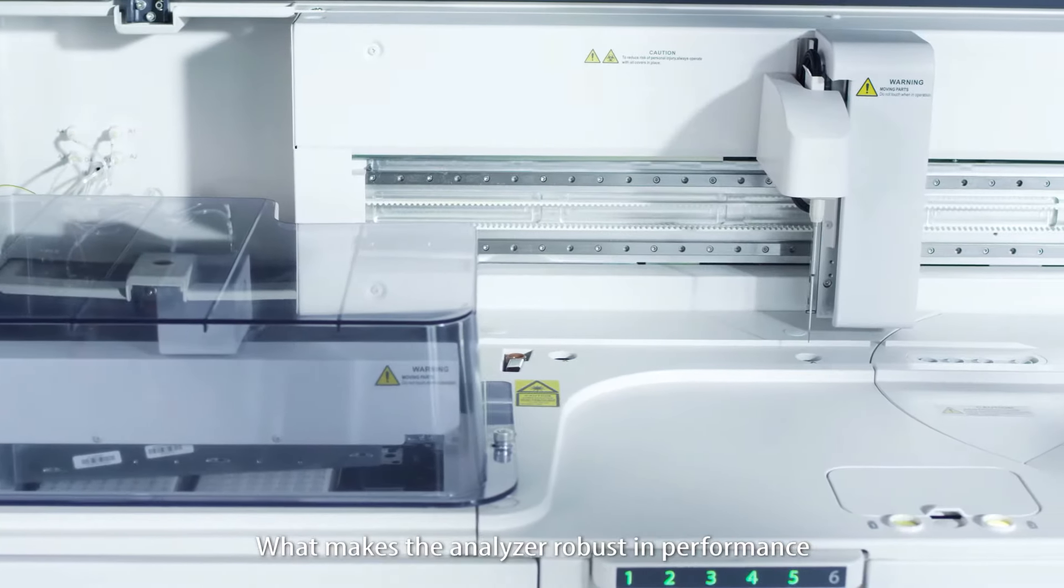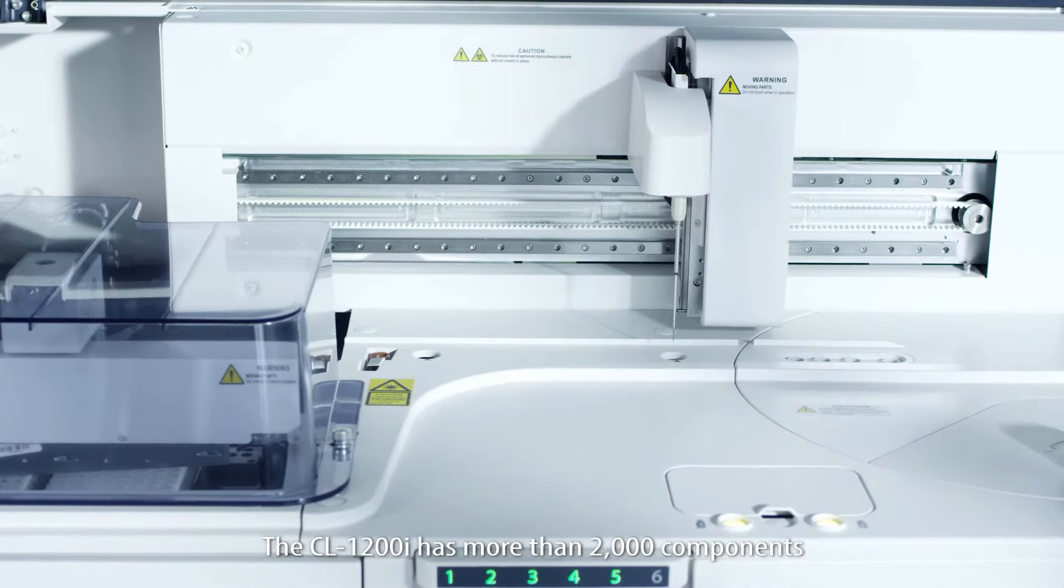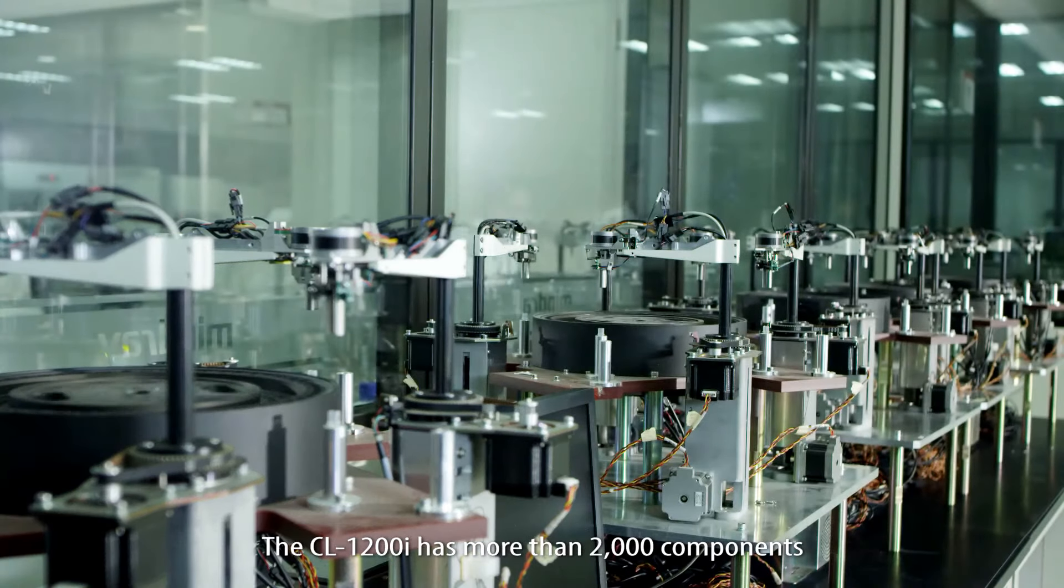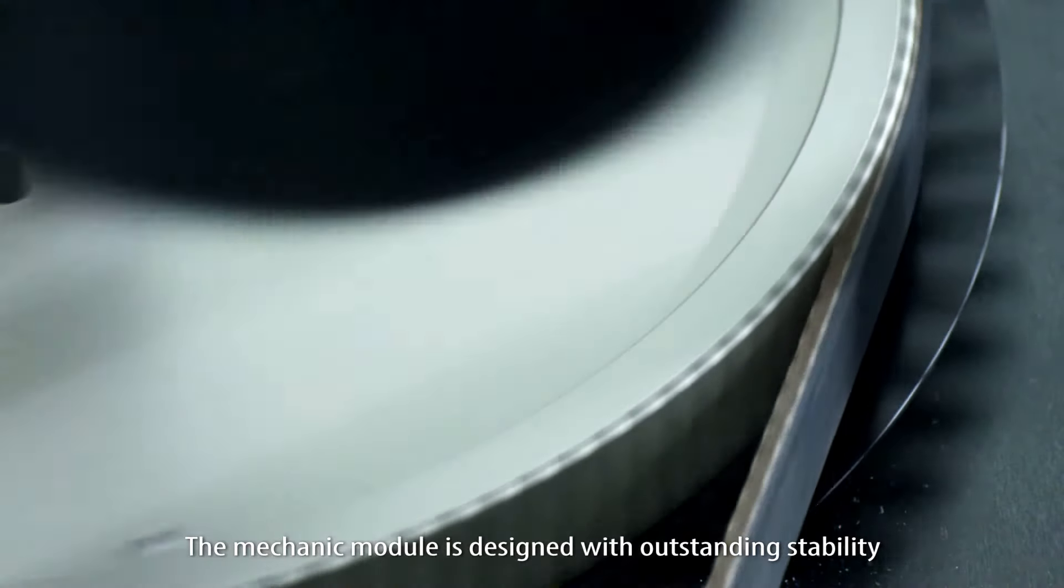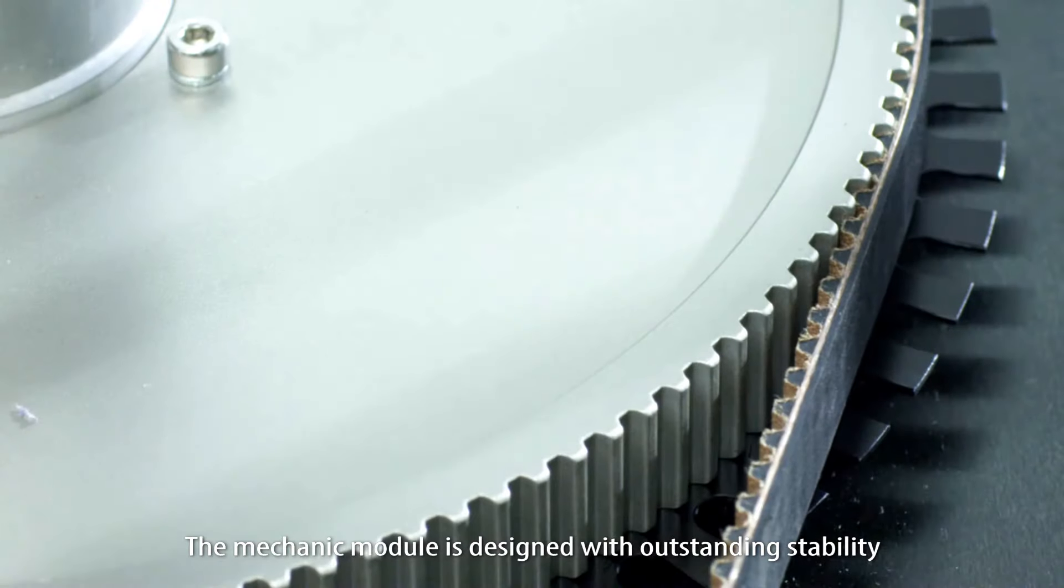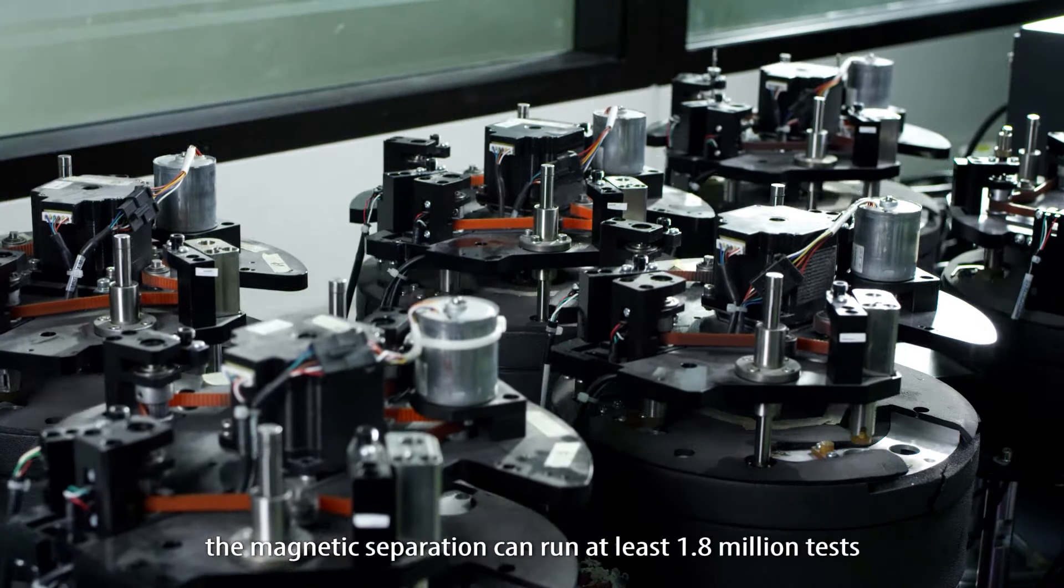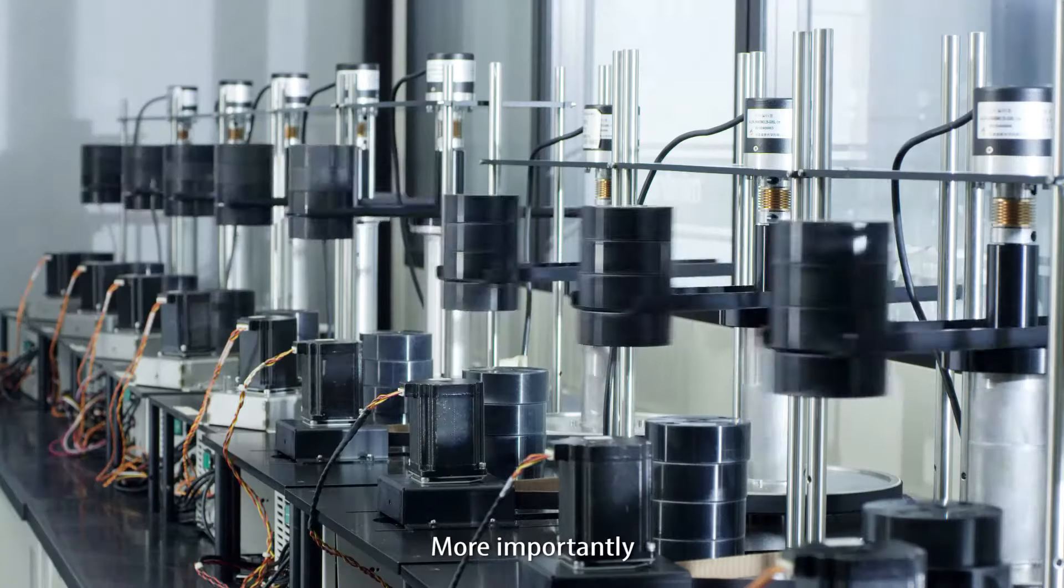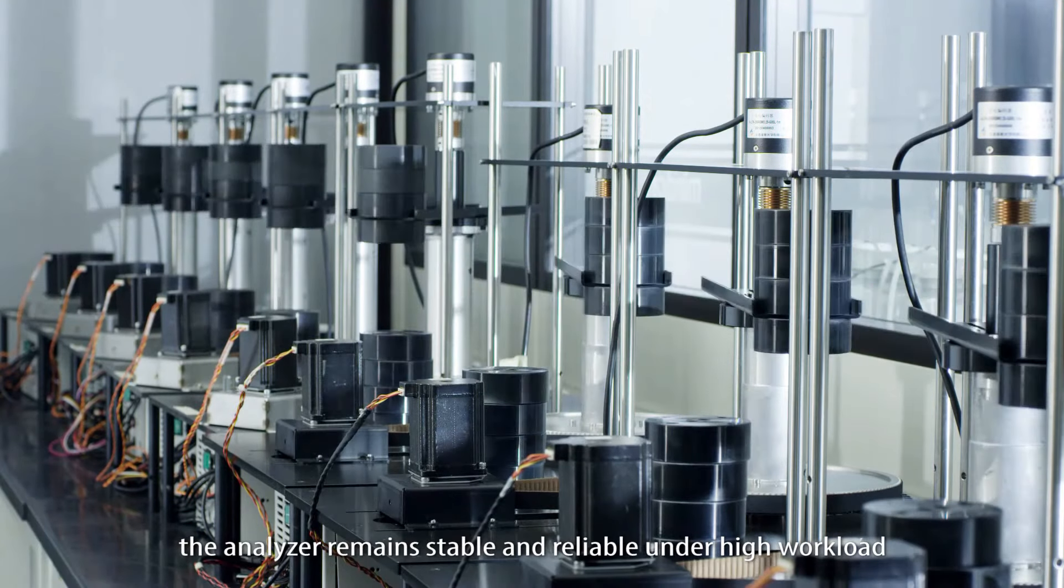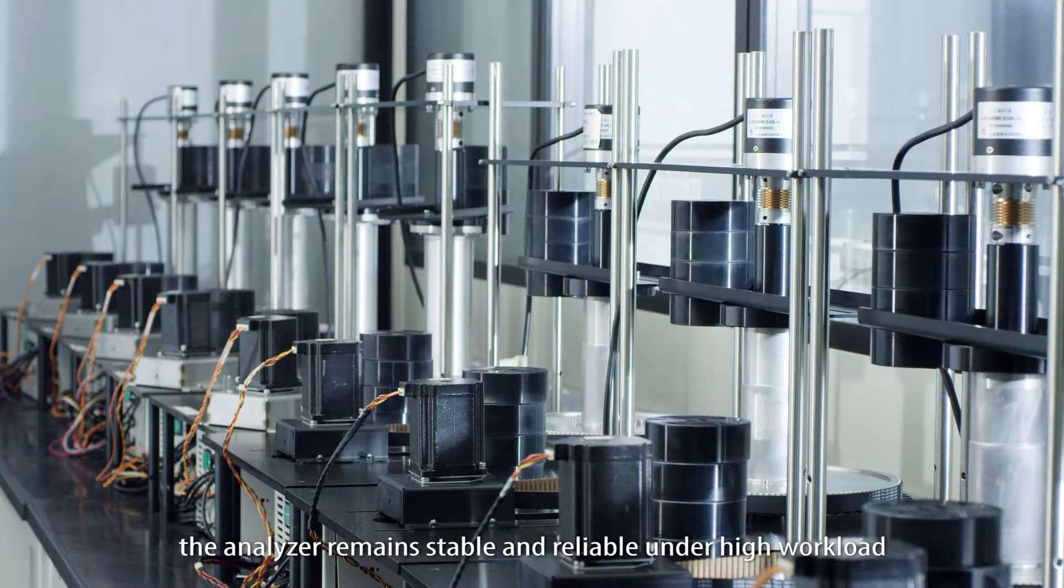What makes the analyzer robust in performance? The CL-1200i has more than 2000 components. The mechanical module is designed with outstanding stability. For example, the magnetic separation can run at least 1.8 million tests. More importantly, the analyzer remains stable and reliable under high workload.